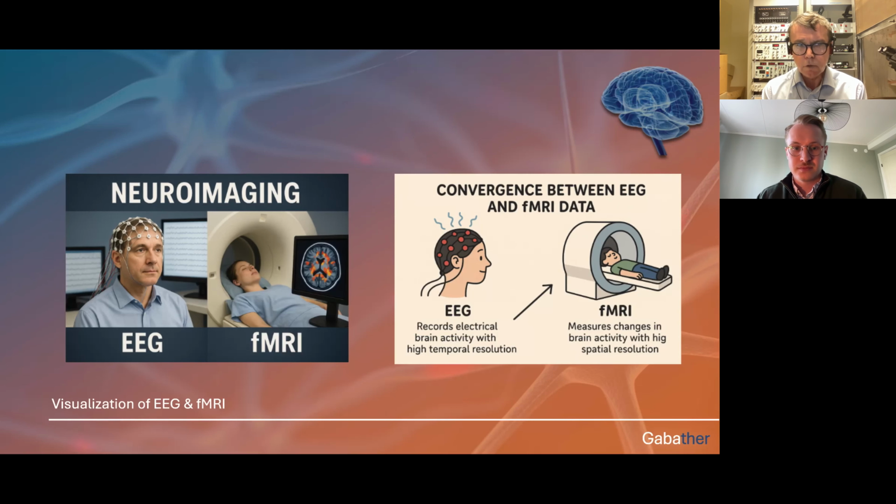In real life, in our experiment, this person going into the fMRI scanner had the EEG cap on, and they were registering EEG and fMRI signals at the same time. So you can imagine, you don't have to be an electrical engineer to think that if you put so much electrical equipment and measure both magnetic and electrical signal at the same time, you have a lot of noise and a tremendous amount of data cleaning that you have to do, so that you're not actually collecting artifacts.